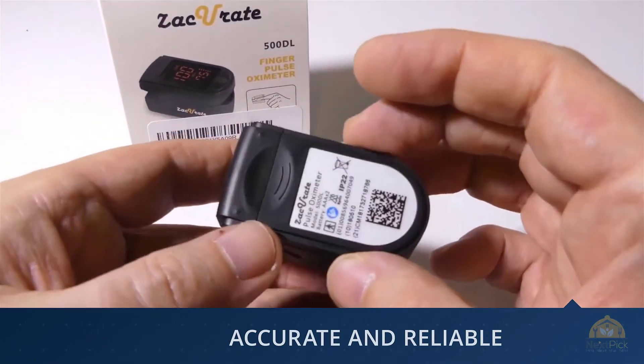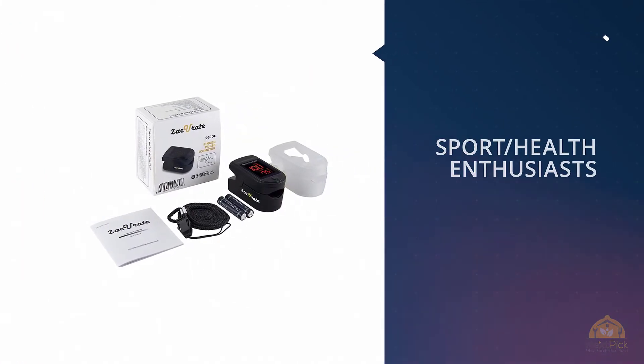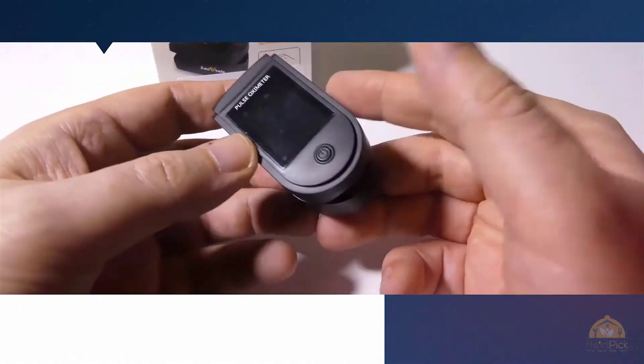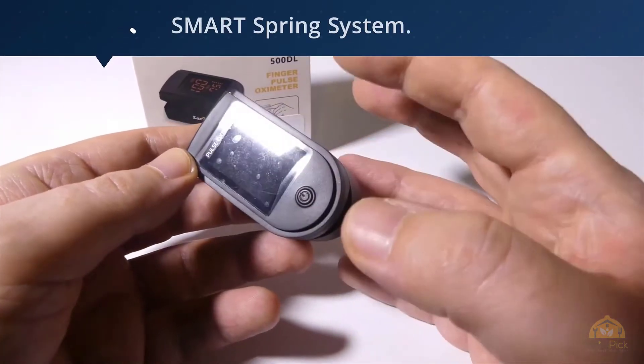For sports enthusiasts like mountain climbers, skiers, bikers, or anyone interested in measuring their SPO2 and pulse rate, the SPO2 and pulse rate now faces toward the user instead of away, for an easy read.